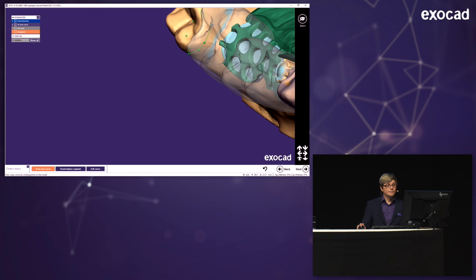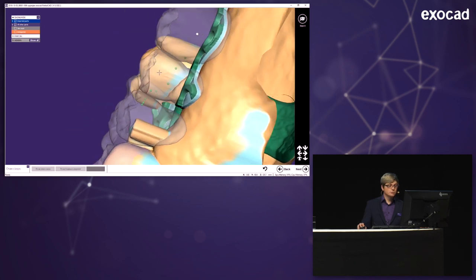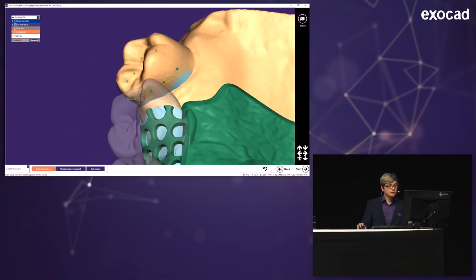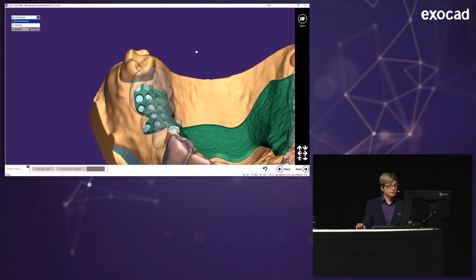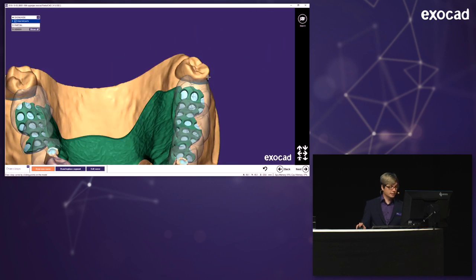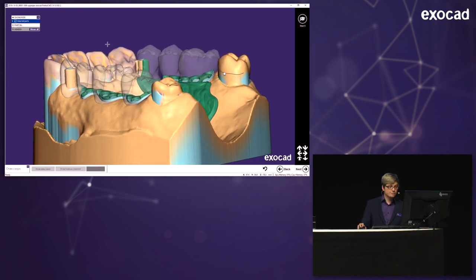This, again, is something where there's many, many different schools of thought how a clasp has actually to look. But I hope this one isn't that bad. And with a double click, I just end the curve. And then I draw the next curve. The clasp isn't finished yet, but at first I have to draw all of the curves.